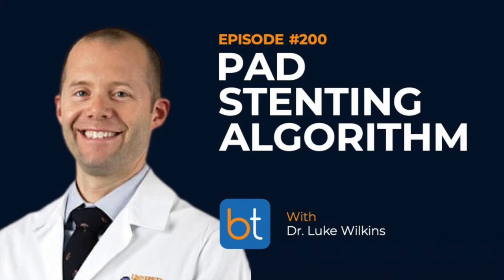In patients that have CLI or CLTI and they're presenting with a wound, that's a whole different story. If they are presenting with a wound and they have fempop disease and below-knee disease, if you fix the fempop disease and they still do not have inline flow to the wound, then I think it is in the patient's best interest to have that inline flow restored. Now, whether or not this fits into how long you have the room for, or how long the patient is able to tolerate the procedure, or if you're going into call time, that's another story. Then those cases can be staged to make it a better experience for the patient and for your workday. But I do think that ultimately those patients require inline flow to achieve healing.